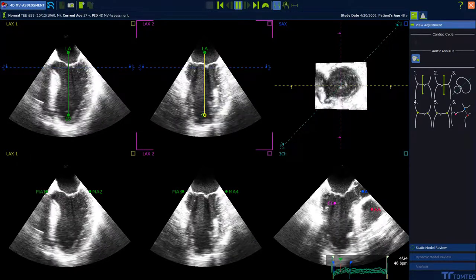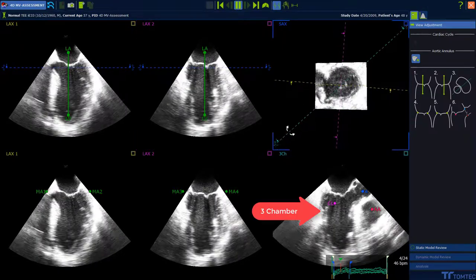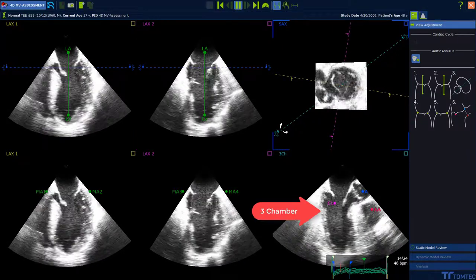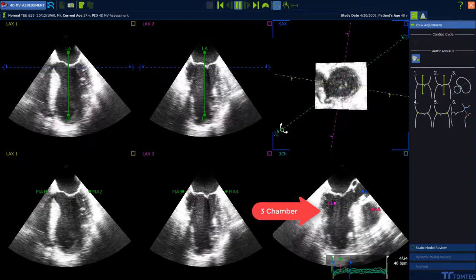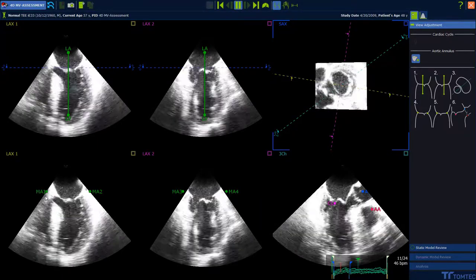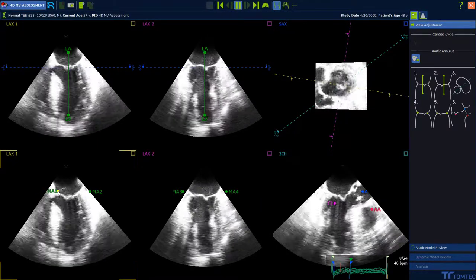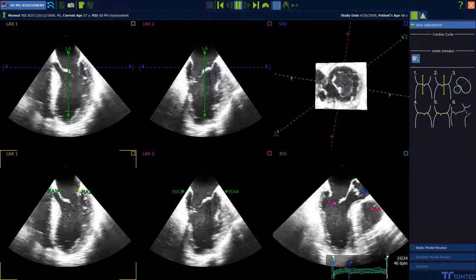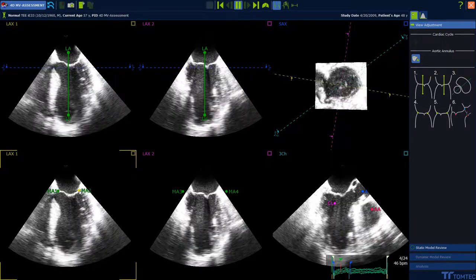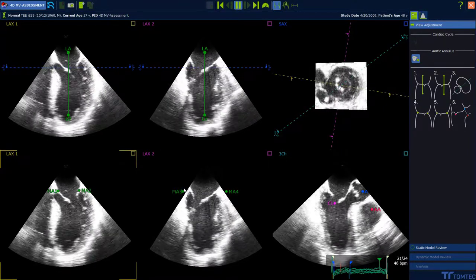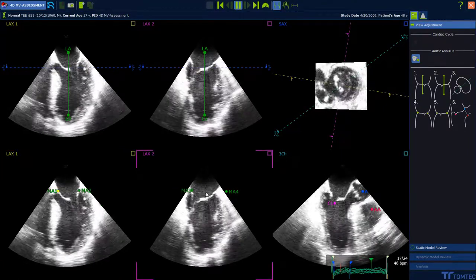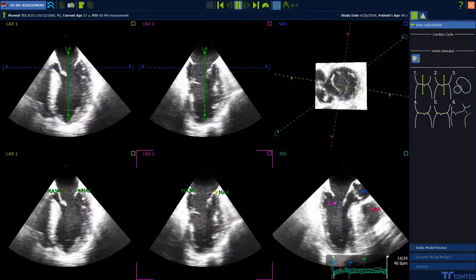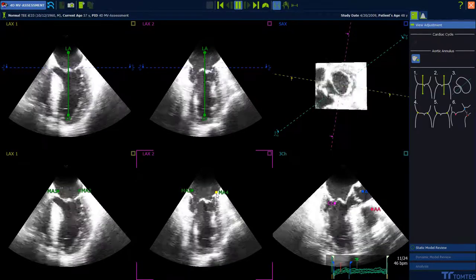Adjust long axis orientation. Rotate the midline until you can see a 3-chamber view on the lower right. Then position all 4 mitral valve annulus points by drag and drop. And then go over for the 3-chamber view next to the right.